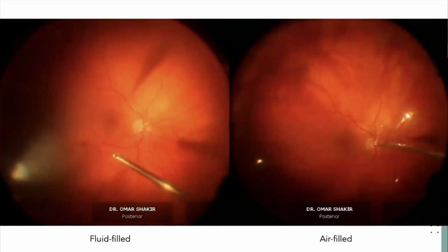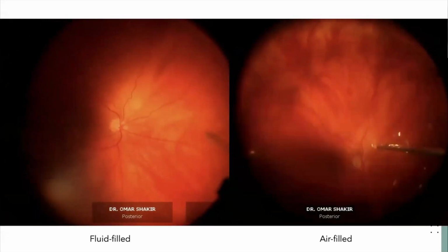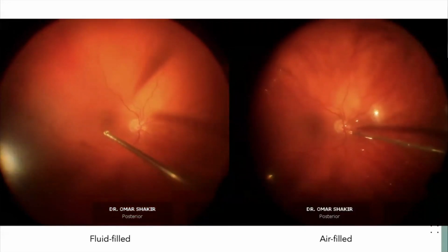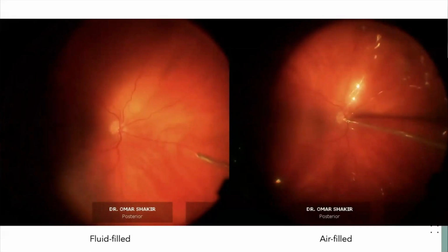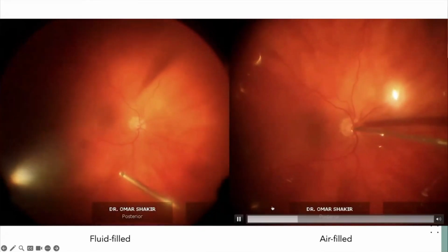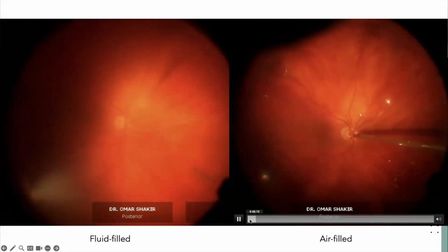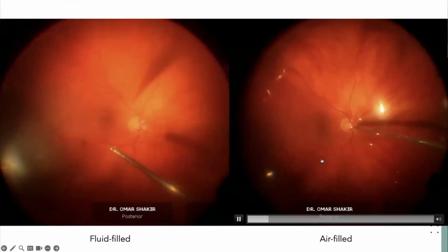So going to that example here, on the left is a fluid-filled eye, on the right is an air-filled eye. I just kind of showed a very small glimpse of the superior periphery there, but sorry, that might be the inferior periphery. But look at the vortex veins and the inferior field of view. So if I rewind this video back here, look at that view back there. You can see all the way almost to ora serrata, versus a fluid-filled eye, you can't get that equivalent view.